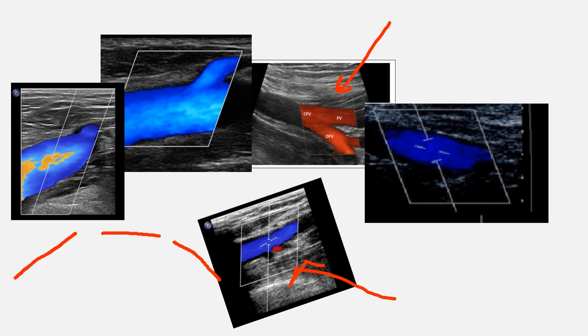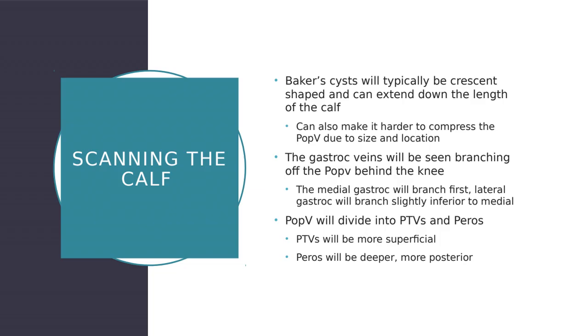Scanning the calf, again, I don't want you guys to freak out about this too much. It's very, very challenging to, one, not only see the calf veins, but two, to know which calf veins are which. So take some time with this. Try to fully understand it. I don't want to stress you guys out about it, but you will be responsible for performing the calf veins.